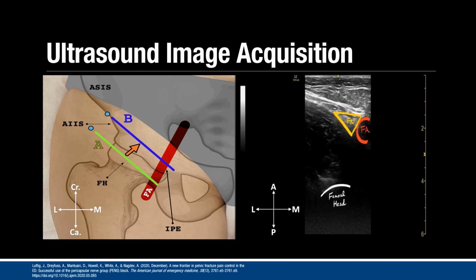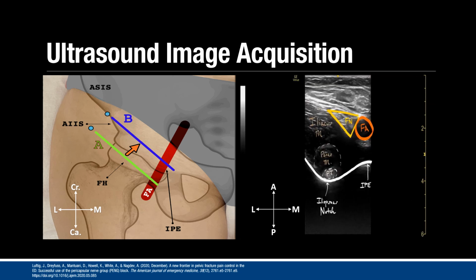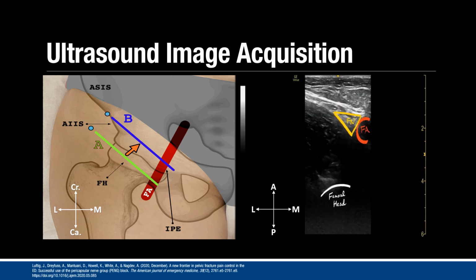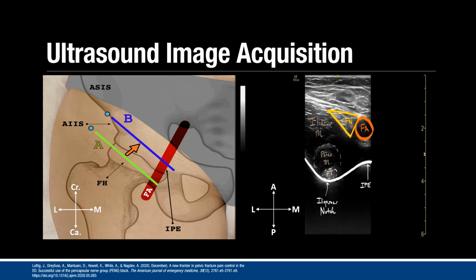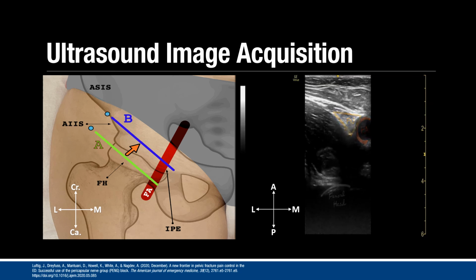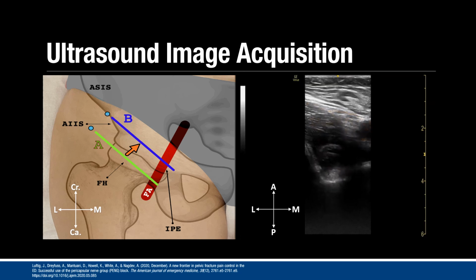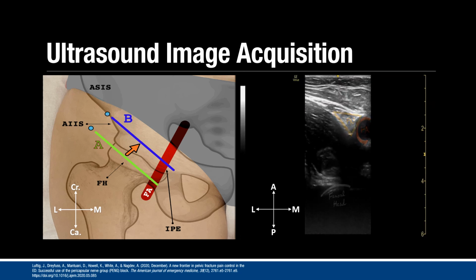Once we see the hyperechoic undulating iliopubic rim, we should be able to visualize the hyperechoic psoas tendon just above the iliopsoas notch. And the injection site target for the PENG block is just lateral and deep to the psoas tendon within the iliopsoas notch. The sonoanatomy clip on the right has been labeled for easier identification of the relevant anatomy structures.